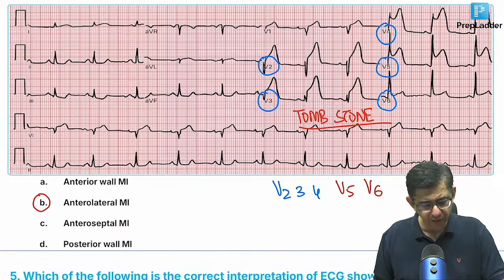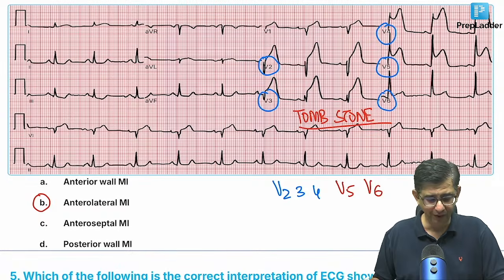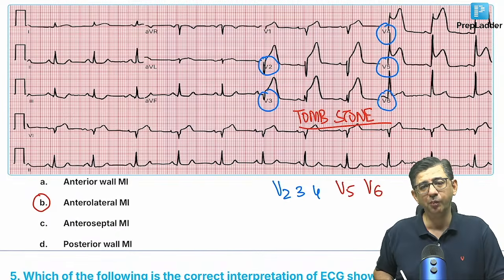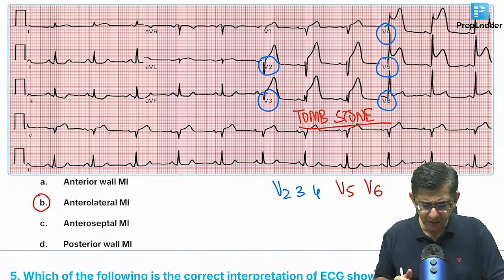Harshvardhan, I think you are listening to our earlier part and we have moved on to the later part. That 2:1, I'll show you the ECG of that. That 2:1 conduction is a variant of Mobitz II heart block where you get dropped beats. But at the moment, what I was describing was a 2:1 conduction occurring in a case of atrial flutter.